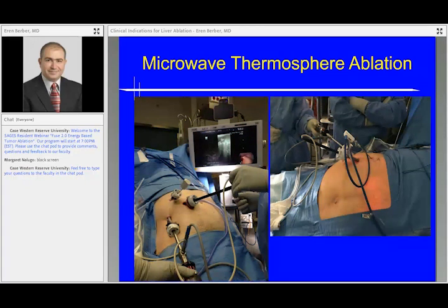In the operating room, we like to do this laparoscopically if possible. There are significant clinical benefits, including obviously minimal invasiveness, fast recovery, being able to stage the whole abdomen, being able to treat multiple tumors in all segments, and being able to move some critical structures away from the ablation zone, such as the diaphragm or the colon or the stomach. Because you're not giving the patient a big incision, the recovery is still similar to the percutaneous ablation. Therefore, as surgeons, we're a little bit biased towards doing laparoscopic ablations.